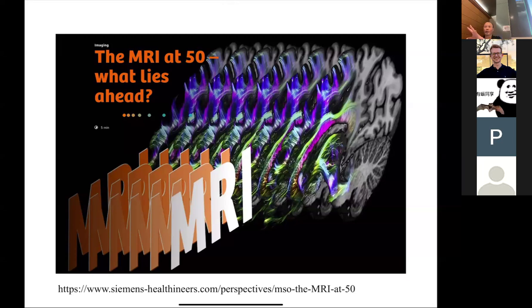And then on the MRI side, you could say, okay, I'm going to limit my gradient strength so that the dB/dt is limited, right? Or I'm going to limit my RF power. And all these things are limited anyways. It may just be that for certain applications, there has to be more customization of those. I'm not too familiar with the specifics, but every manufacturer focusing on that would have to look at those three main areas.